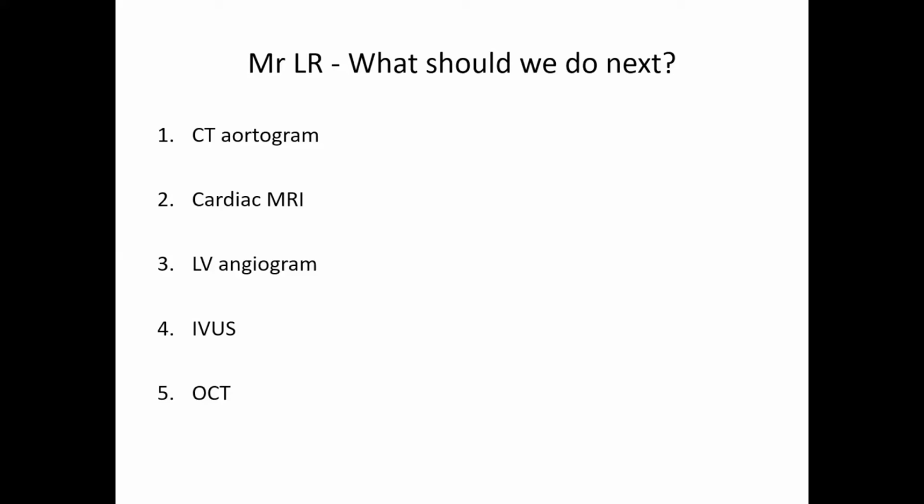Yeah, I'm sharing the result. I think some of these things are not mutually exclusive. If you have done intracoronary imaging because your coronary catheters are already there, it does not stop you from doing an LV angiogram, depending on what you think, and afterward that does not stop you if you are thinking that it's an aortic problem or a myocardial problem. So I agree that I will go for a form of intracoronary imaging.